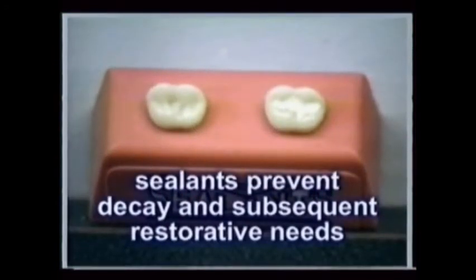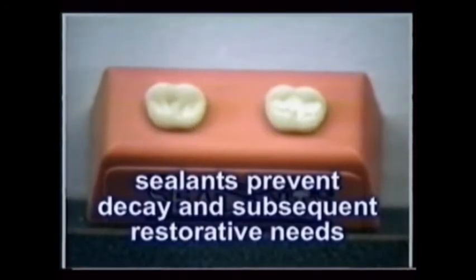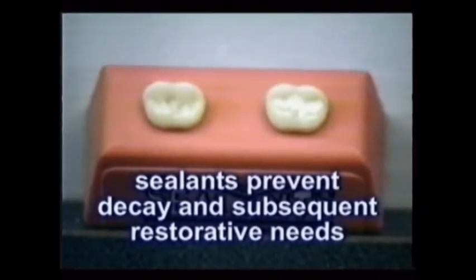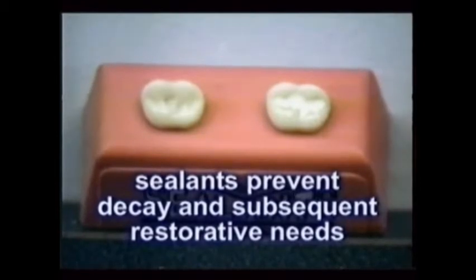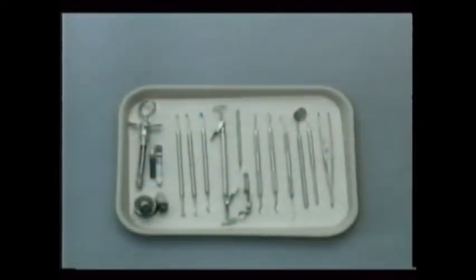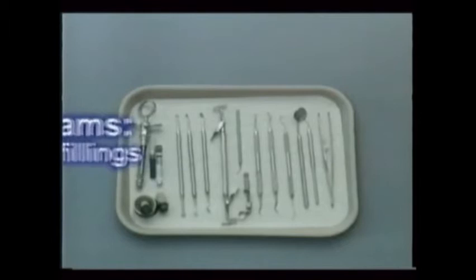Sealants can be our first defense against decay that can ultimately lead to major restorative needs. Encourage patients to seal teeth wherever needed and possible, and you can prevent a lot of possible dentistry having to be done later in their lives. Since the array of materials and instruments needed for restorative dentistry is so vast, let's look at them in use for the different procedures.